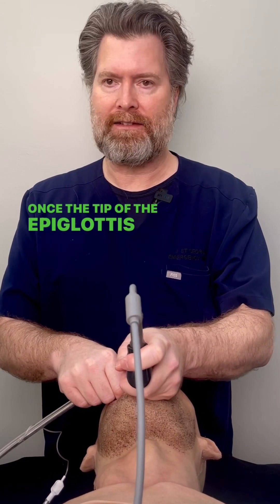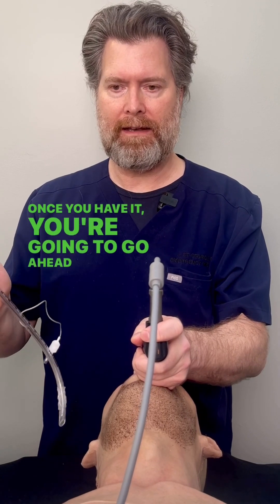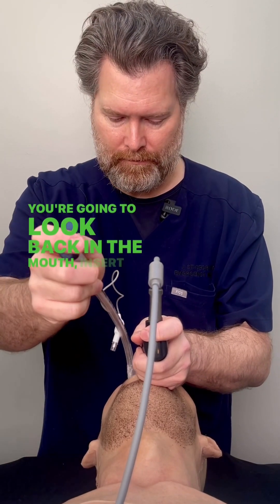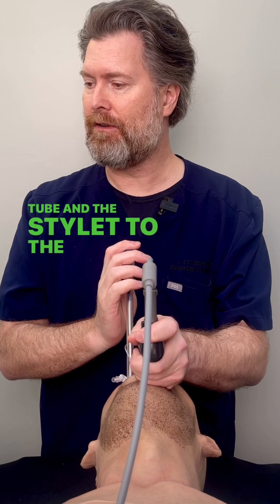Once the tip of the epiglottis comes into view, you're going to go ahead and seat in the vallecula until you get that great 50-50 view. Once you have it, you're going to pick up the rigid stylet on the tube. You're going to look back in the mouth, insert the tube, and then look back up at the screen and guide the tube and the stylet to the glottic opening.